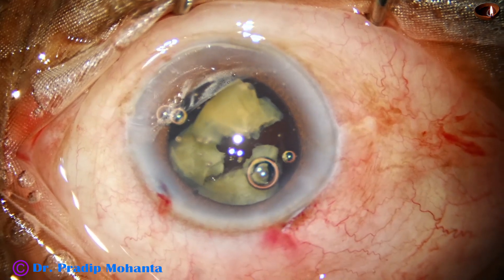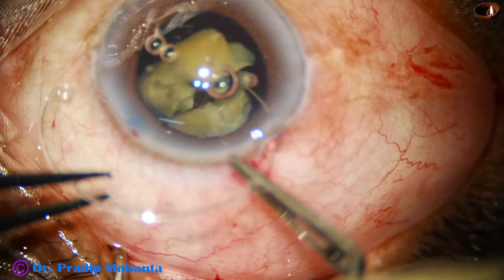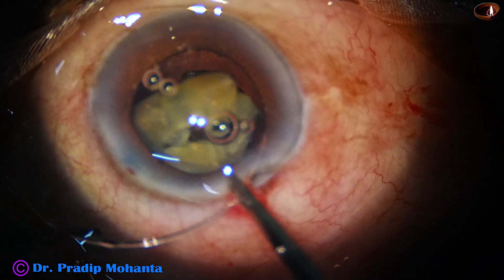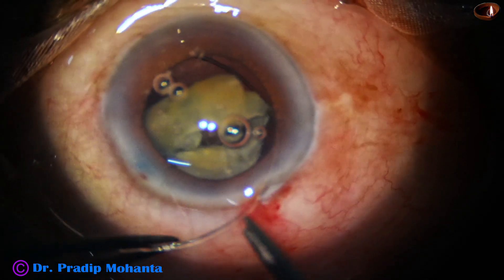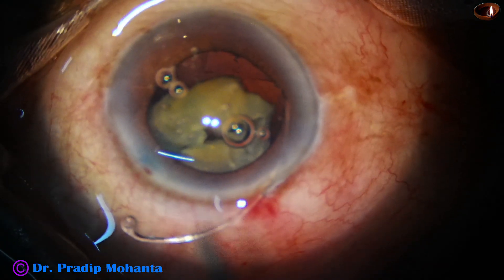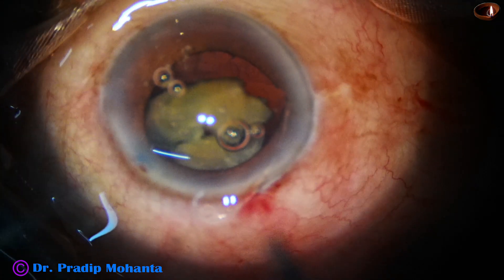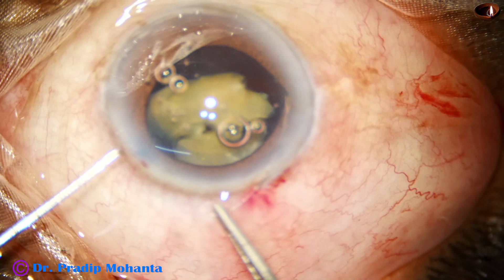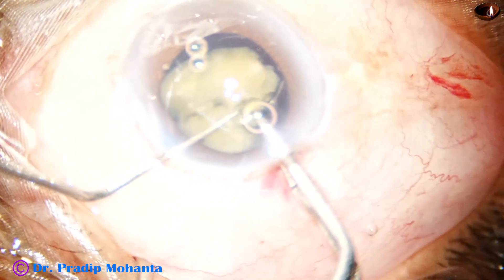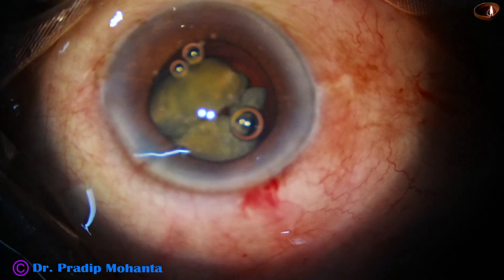My plan is to apply a capsular tension ring immediately. The leading end of the capsular tension ring goes into the capsular bag and we are gradually advancing. We have to be very gentle in every step. You can see there is a kink at 9 o'clock, which means the portion that has gone is in the bag. Now hold the trailing end and use the Sinskey hook. The Sinskey hook goes in the opening and pushes the capsular tension ring into the capsular bag.